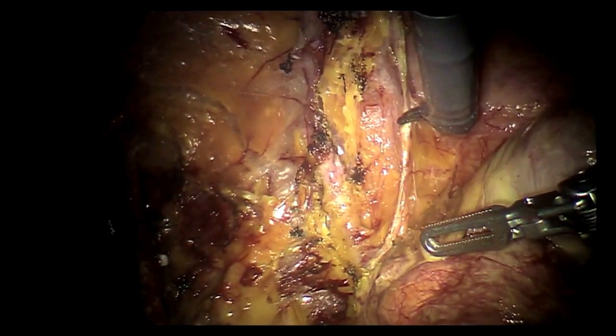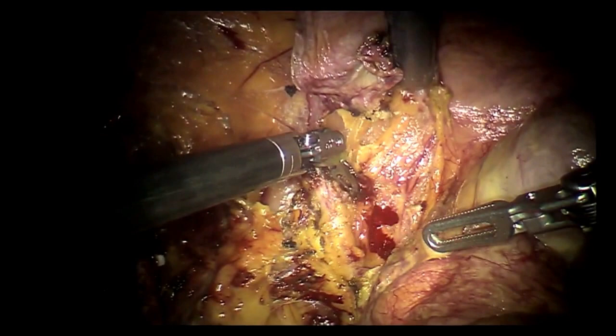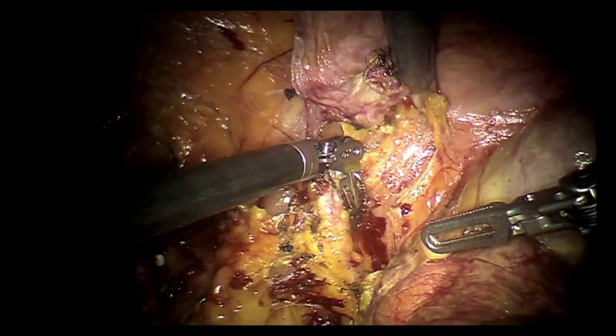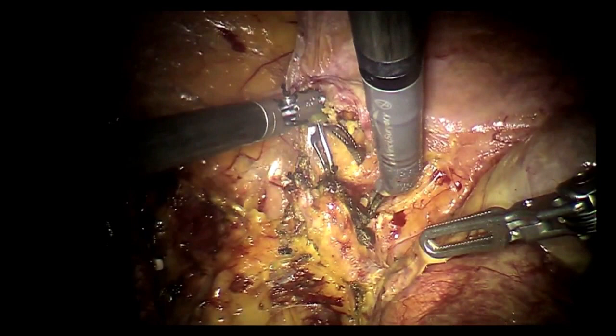Dr. Gill, have you been doing this flap since the beginning of your transplants, or have you modified it more recently? More recently. Initially we just put in a stitch. Have you ever had any intra-abdominal torsion in your series?